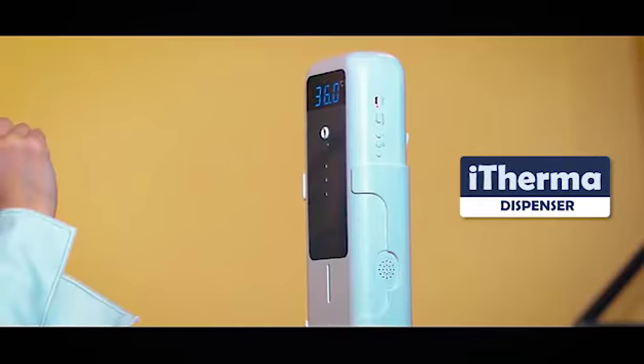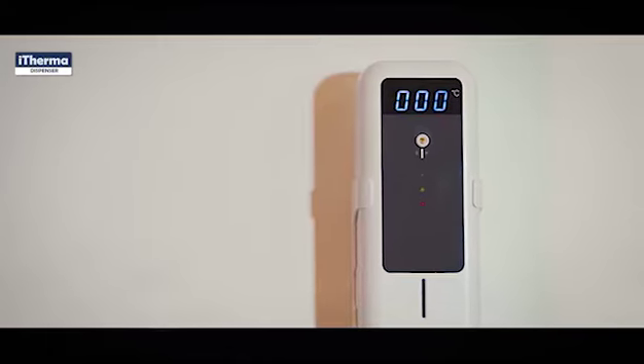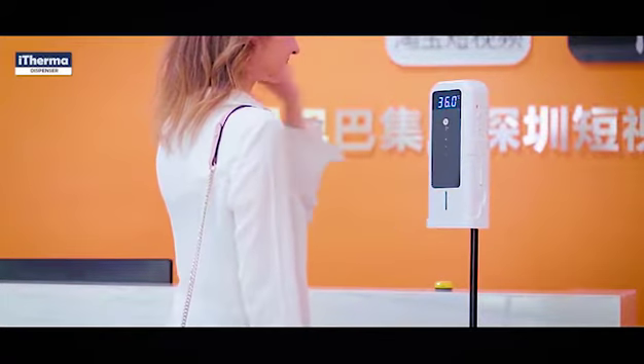The i-Therma Dispenser is a contactless automatic fever screening device with built-in sanitiser dispenser. It features a high precision infrared sensor for fast and accurate body temperature readings.